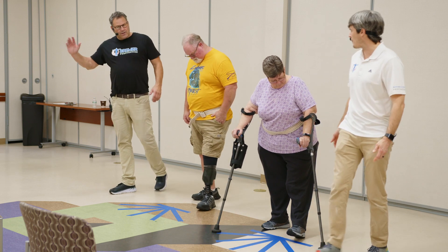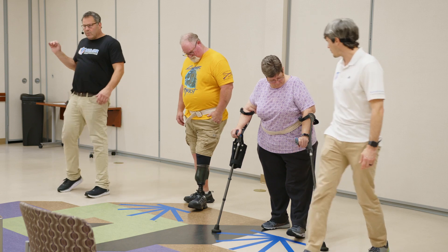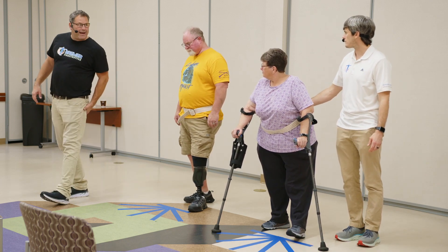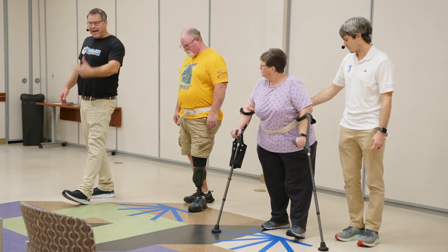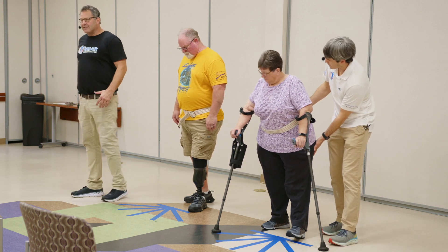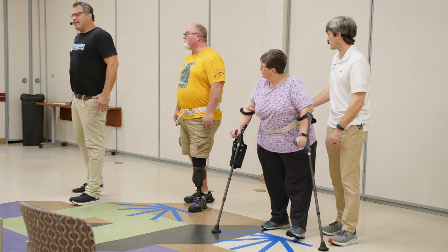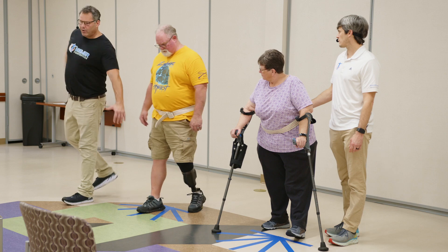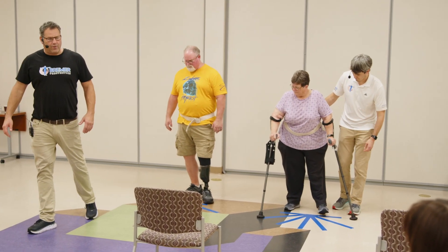That's why they're called pull-throughs — you come back to the toe and then pull through. When we did the heel strikes, we're using those extensors, pulling back here. The heel is already on the ground, but imagine you've already struck it there and you're just going to pull yourself through. But here's the catch: you're not supposed to push off on your sound leg. You're going to literally pull yourself onto the prosthesis and come forward.